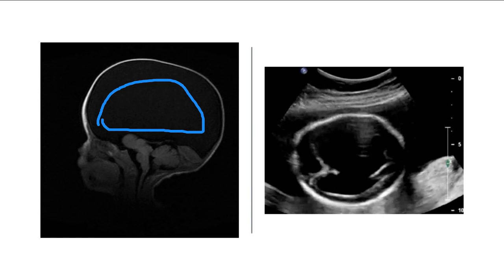Now this is different than ventriculomegaly, right? Because in ventriculomegaly, we still have that cerebral tissue that wants to function. It's still getting blood supply to it, but for some reason, the ventricular system is dilated. So we just get all of this fluid. In this case, hydranencephaly, we have replacement of that brain tissue because the brain tissue is dead because it didn't get any blood supply from the carotids. So now it's being replaced with the cerebral spinal fluid.